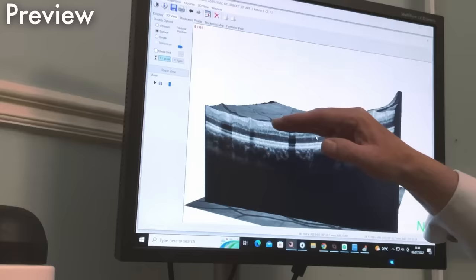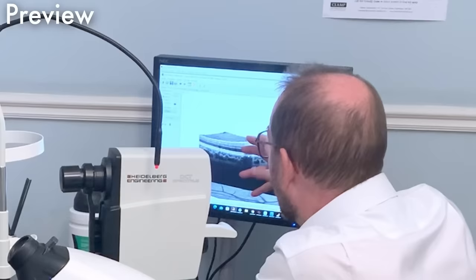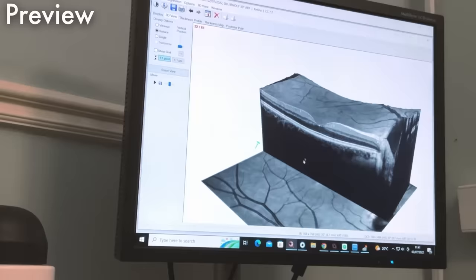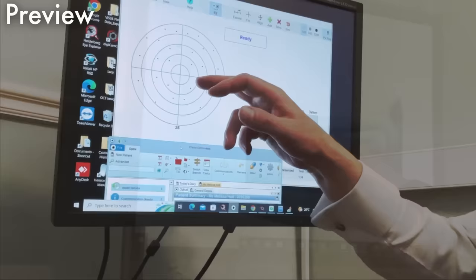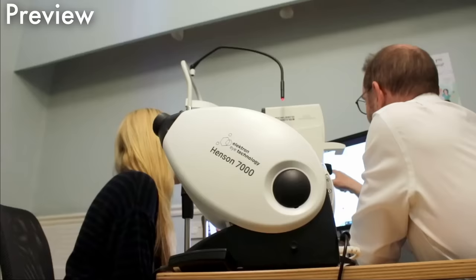So if we slide through it, each beep when it was taking the scan was a cross section through it, and then it creates this block which we can look at, and then in a minute we'll get to the center of your macula there. So that's where the detailed vision is. So if we look from above, that's where it dips. So the center of that cross is you looking straight ahead, and then you're sort of 30 degrees to the left, right, and up and down. Okay. So it's testing areas within your visual field. And if you miss a spot, then it highlights it.